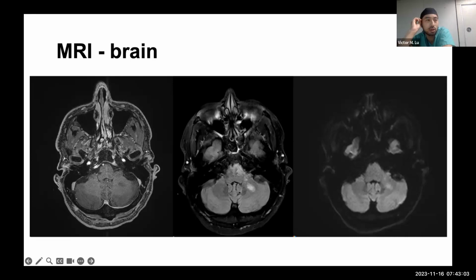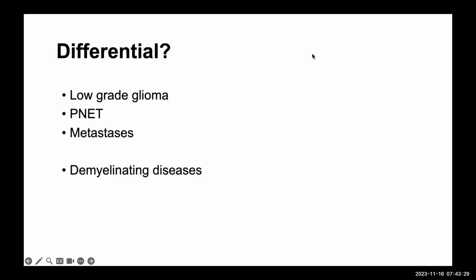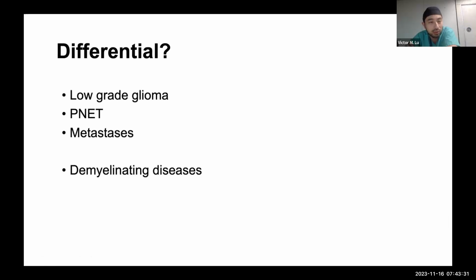Okay, and so just to go back to the glioma differential, do you have a particular preference for high grade, low grade? Based on this imaging, with the brainstem involvement, this could likely be a high grade glioma. All right. With those type of sequence appearances, low grade is always a question. But you're right, if it is a midline lesion that has a particular mutation, irrespective of what you see on imaging, that could also be classified as high grade.